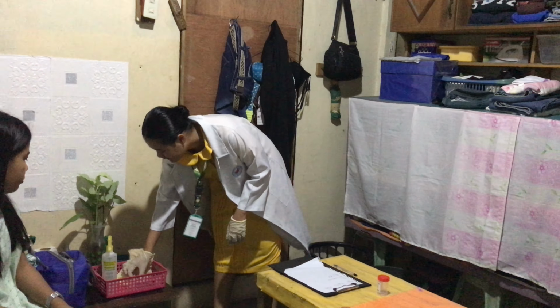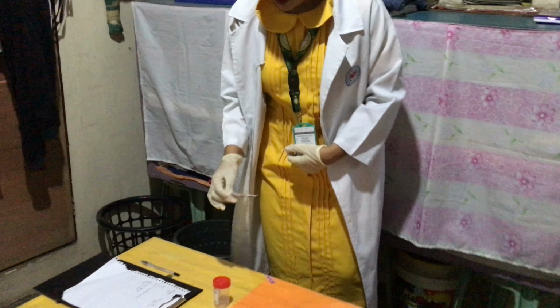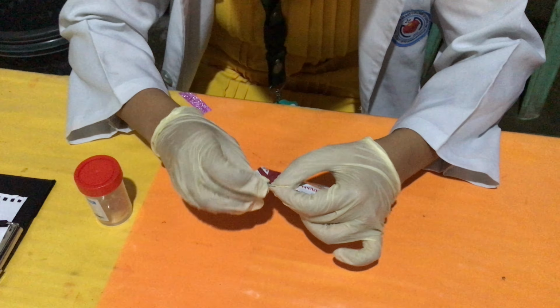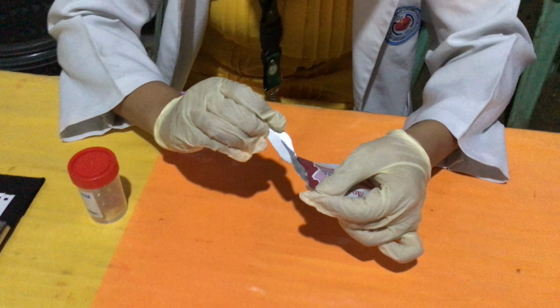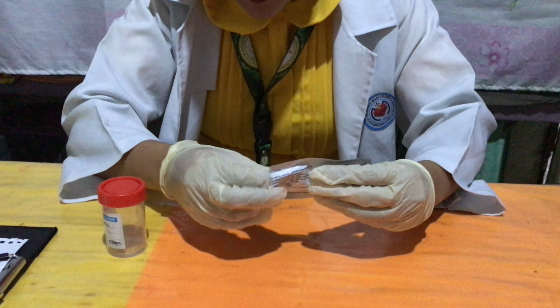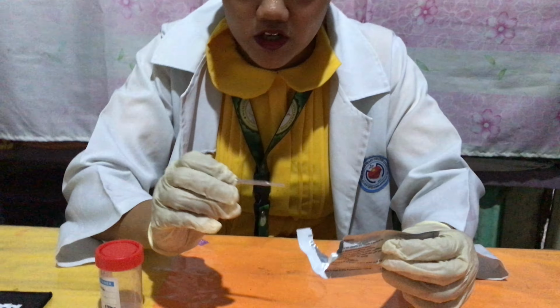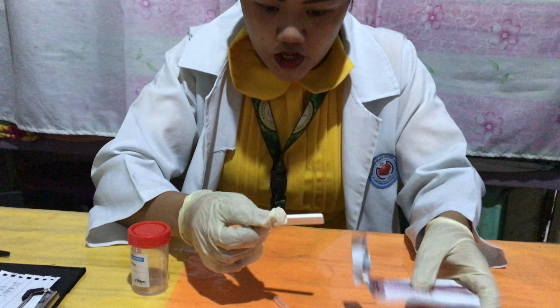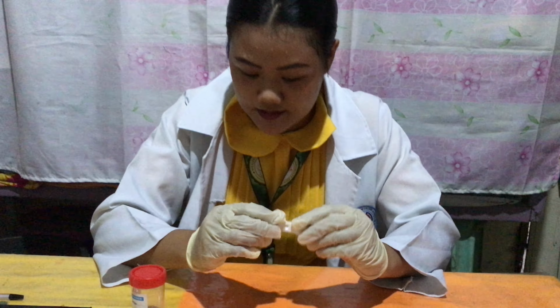After I wear gloves, I will be now opening one of the pregnancy test package kits. So let's go here on the examination table. Okay? So we have here, as I have mentioned earlier, the dropper, and then the indicator kit or the pregnancy kit itself. Okay?